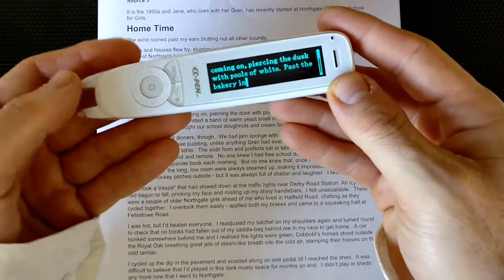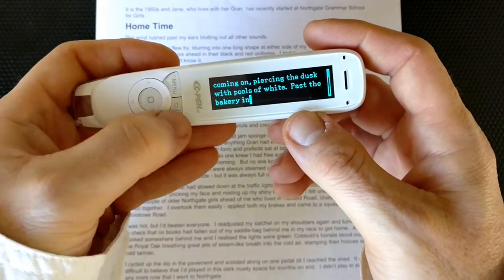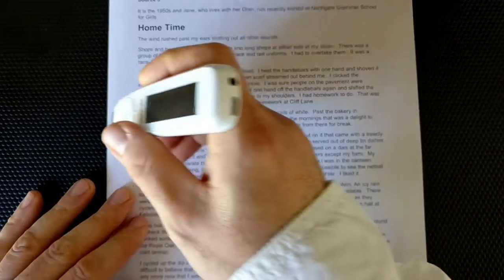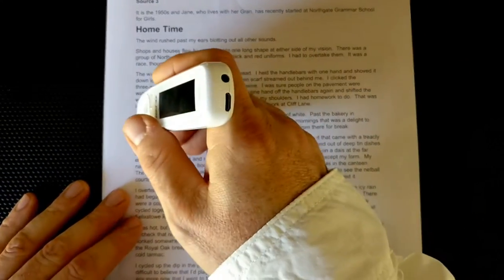It works perfectly on one line. Now, it only does one line at a time, so I just use the back button to go out of that mode and start over. But you can also scan a whole paragraph and then scroll up and read it. So let's try that.